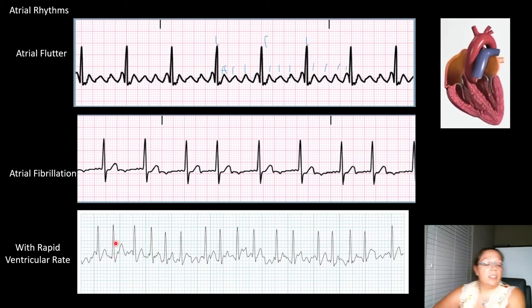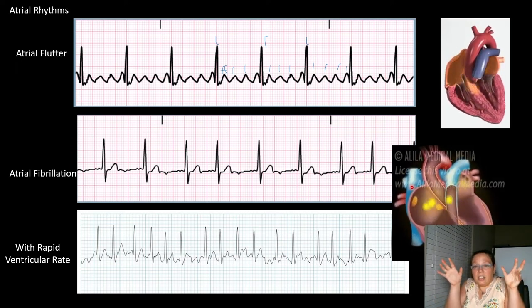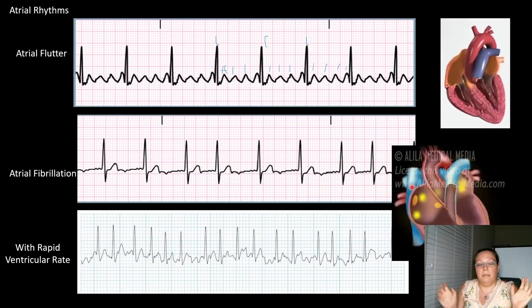A lot of times what we need to do when we have AFib with RVR is slow that rate down. So we'll give metoprolol or amiodarone, something that will help slow the heart rate down and block some of those signals. So what does this look like? Well, you can see all these yellow dots are electrical activity in the atria, and only once in a while do you get one down to the ventricles. Your atria up here are just jiggling. They don't know what they're doing. Your ventricles are still with the show, but your atria are jiggling.